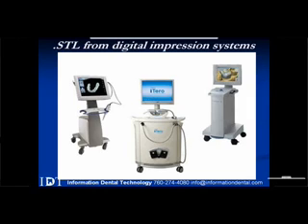Blue Sky Plan allows both techniques to be used, the dual scan and importation of the STL that Cindy was just describing.